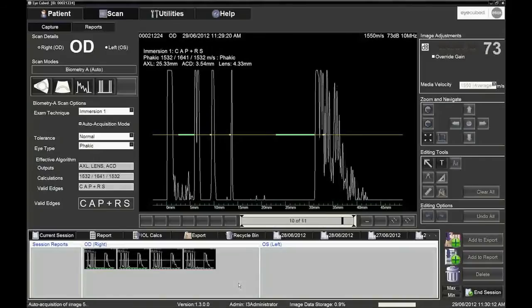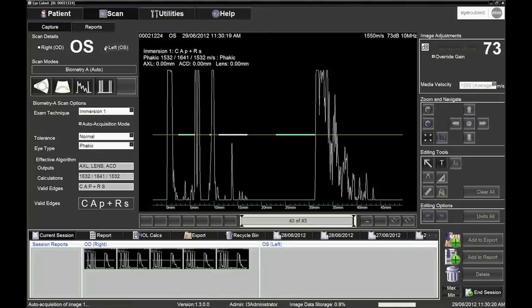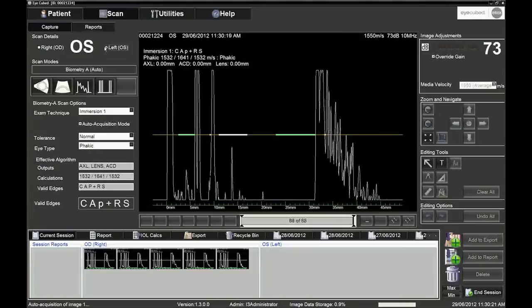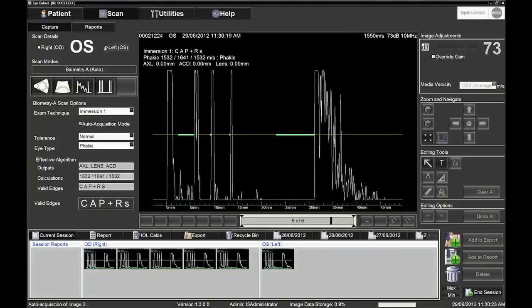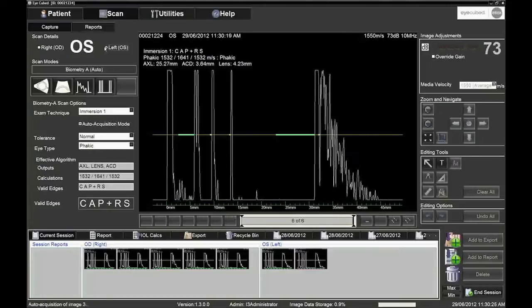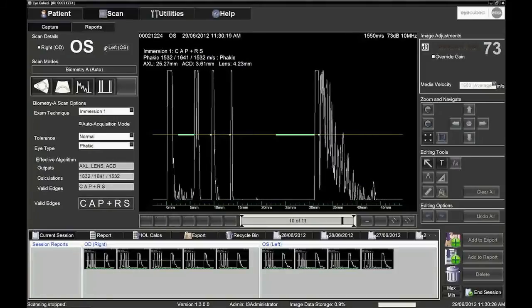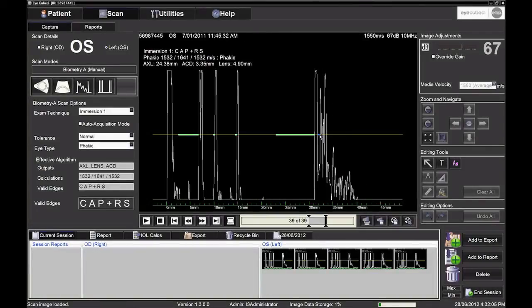In automatic freeze, the system automatically freezes five pictures which meet the correct criteria. It is recommended that you always check the images that are frozen automatically to ensure that the correct echo pattern is displayed and the markers are positioned before the correct echo spikes.